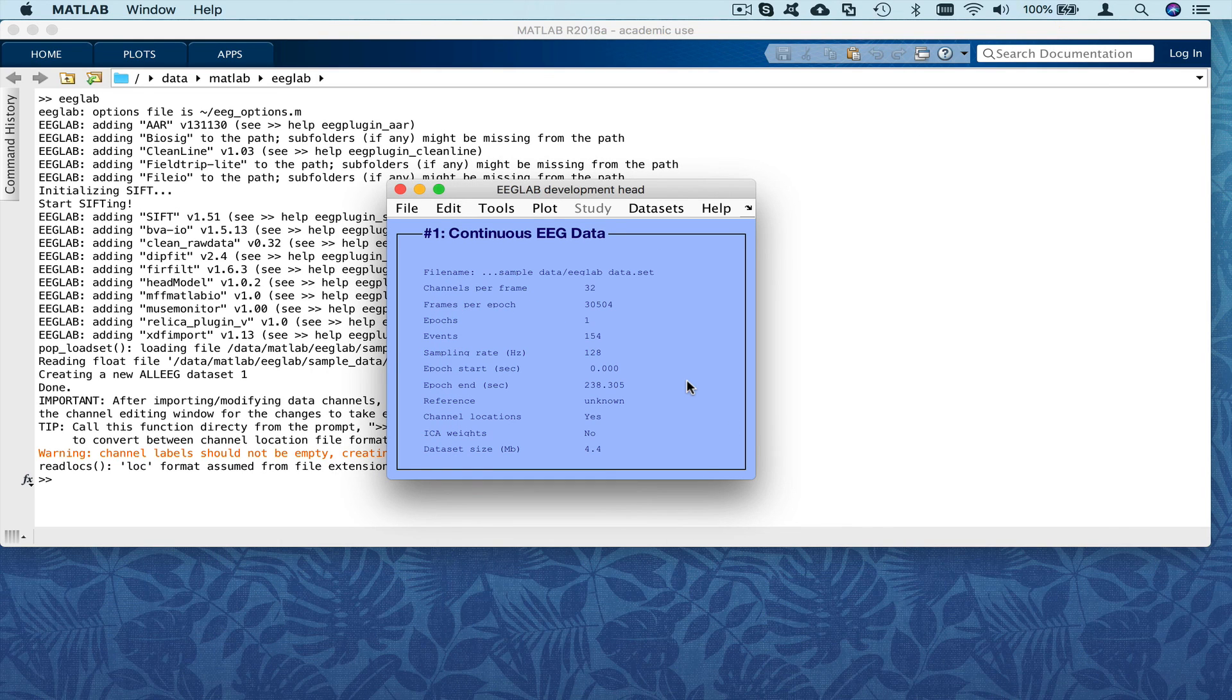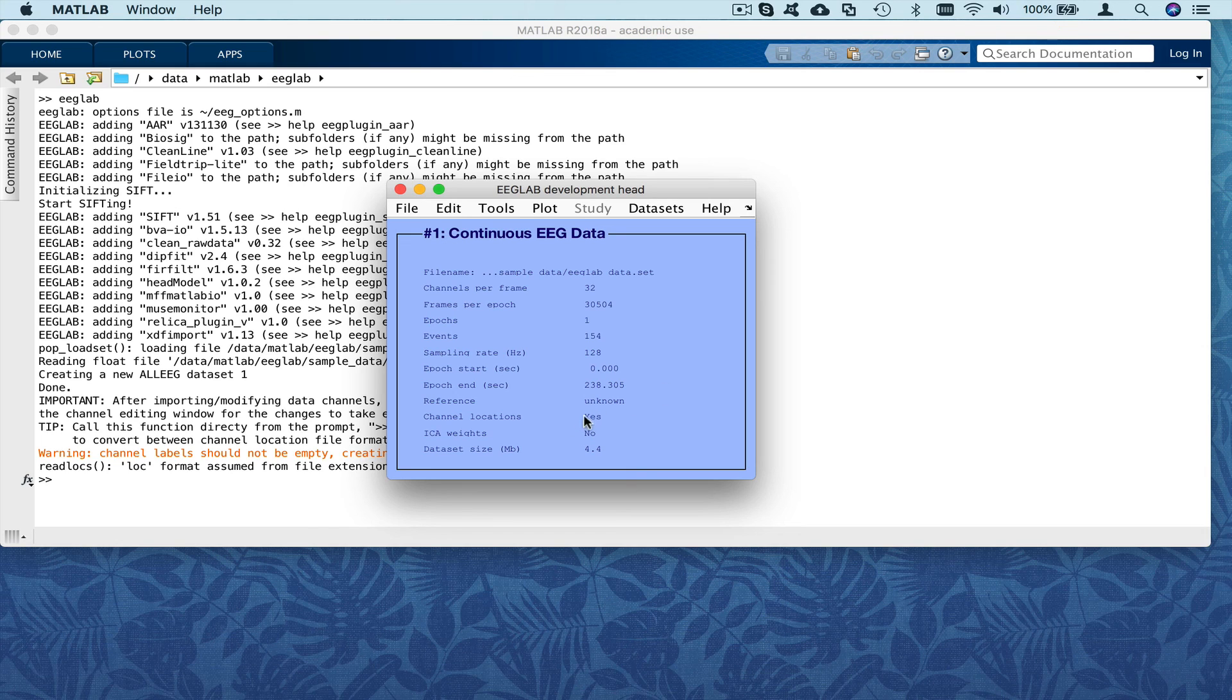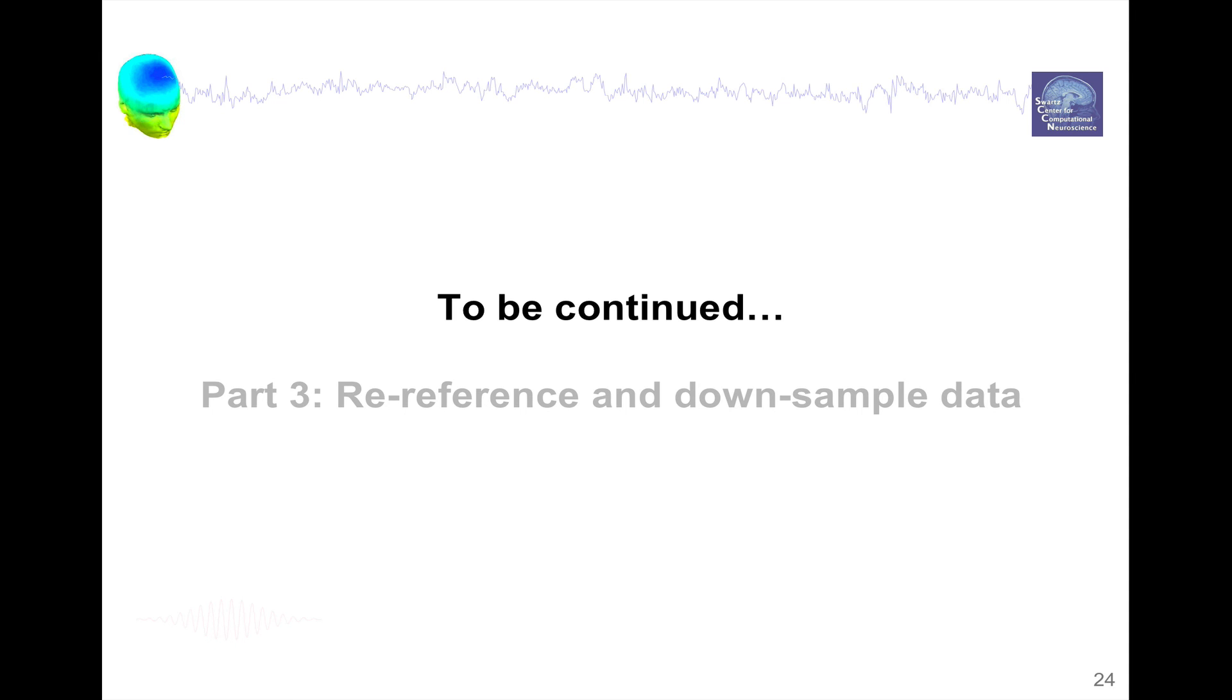And we press OK. And now if we look at the main interface, channel location reads yes. So this is the end of part 2. In part 3, we will talk about re-referencing and then sampling EEG data.